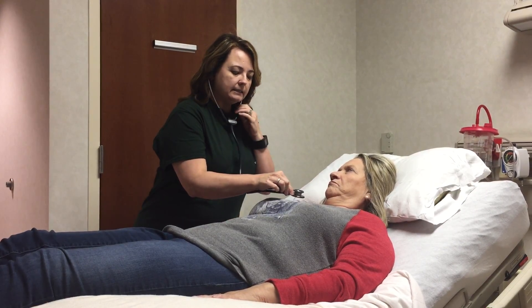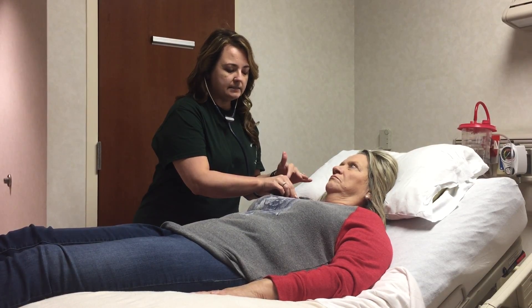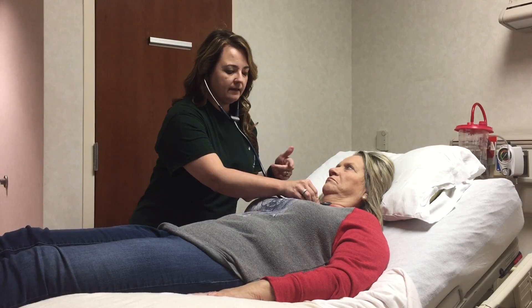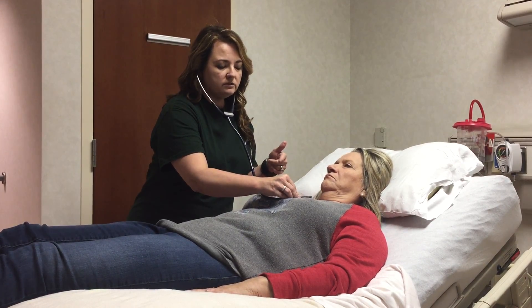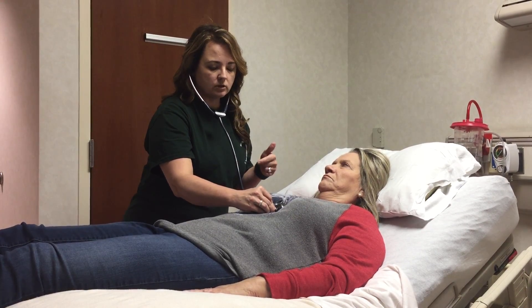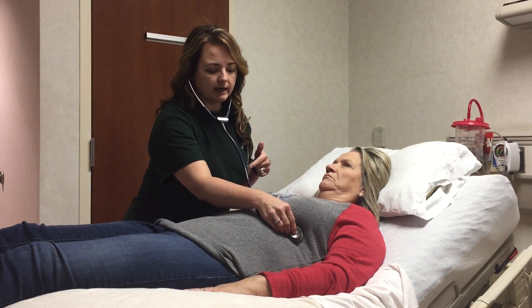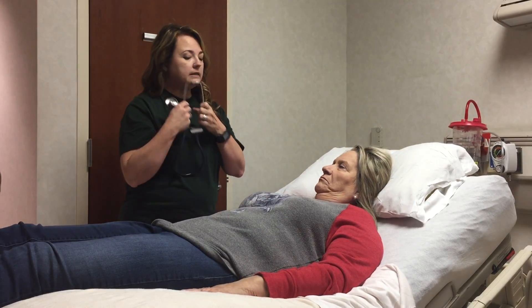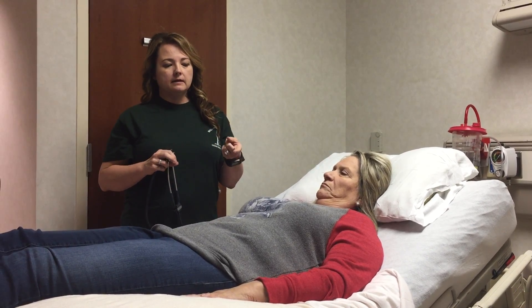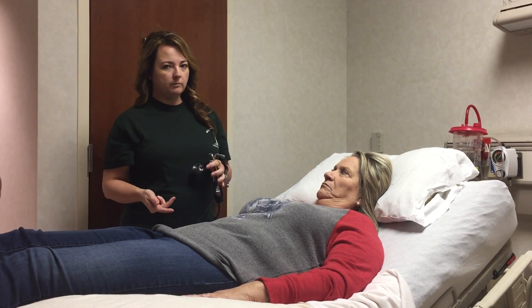I will start by listening in the aortic area, which is on the client's right side, second intercostal space. Moving to the pulmonic area, which is the second intercostal space on the left-hand side. Moving down to the third to fifth intercostal space, which is Erb's point, then to the fifth intercostal space, which is the tricuspid area. Staying at the fifth intercostal space and moving to the mid-clavicular line, which is the mitral area. If I noticed any irregularities in the heart rate, I would check for a pulse rate deficit by listening at the apical area and palpating the radial pulse for one full minute at the same time.